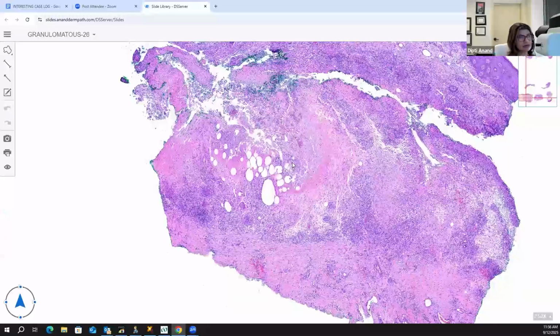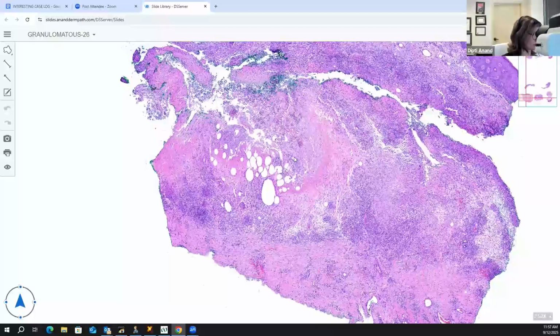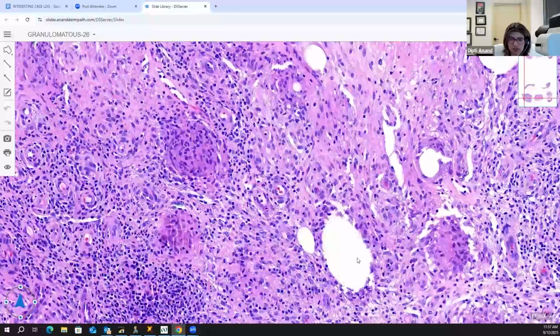And a paraffinoma is a specific kind of foreign body where the features are very subtle actually. We'll talk about it more when we do foreign body, but it doesn't incite a really necrotic response. It's subtle. It's a foreign body which is quiescently sitting out there, not really damaging the skin, but it is there. Okay, so foreign body is one, so you definitely would polarize it. But what are these that you're seeing over here?